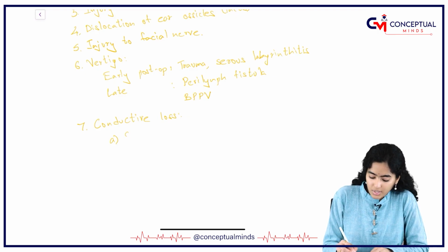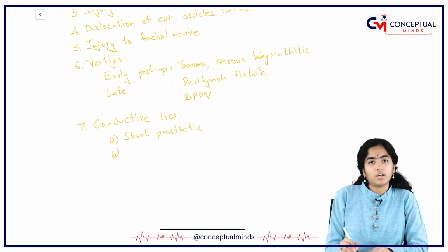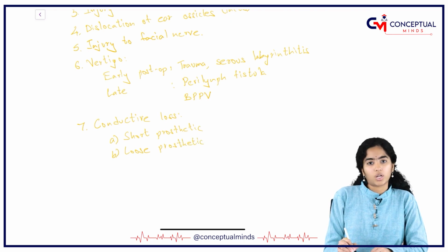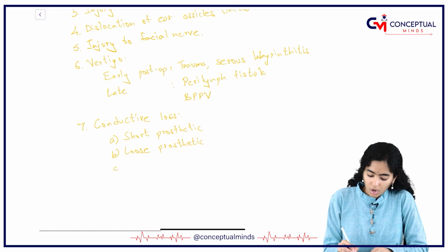Either it is a short prosthetic, or it is long and loose prosthetic, not exactly fitting into the stapedotomy hole, or displacement of prosthetic.